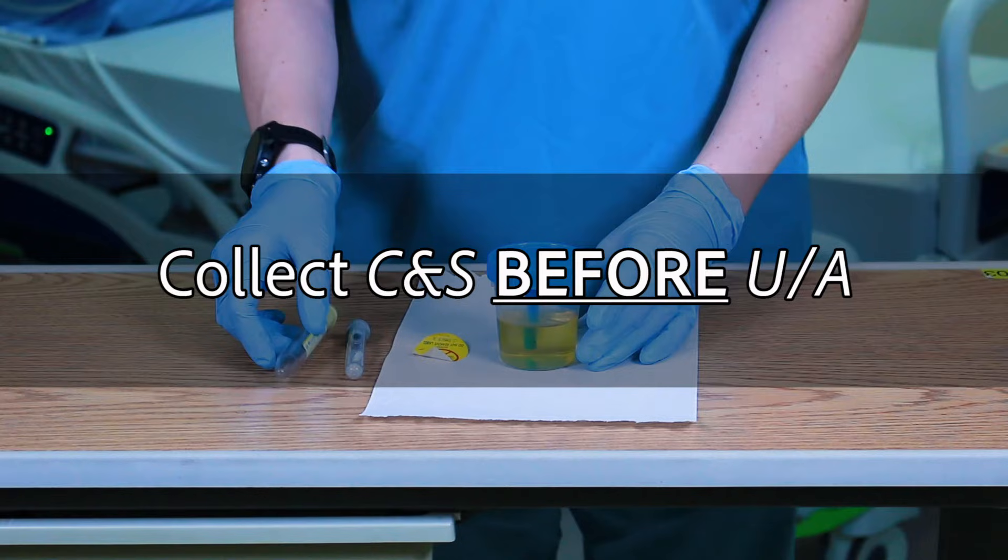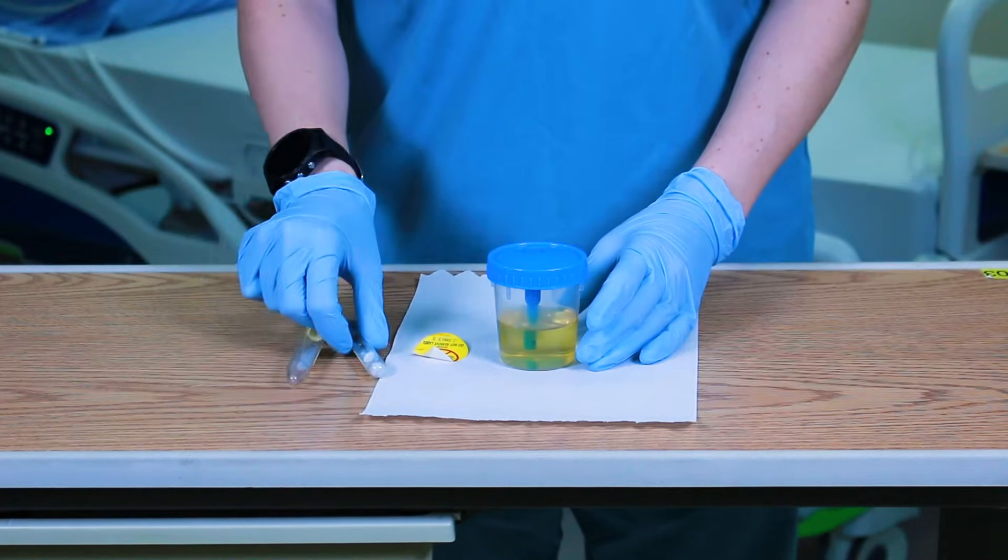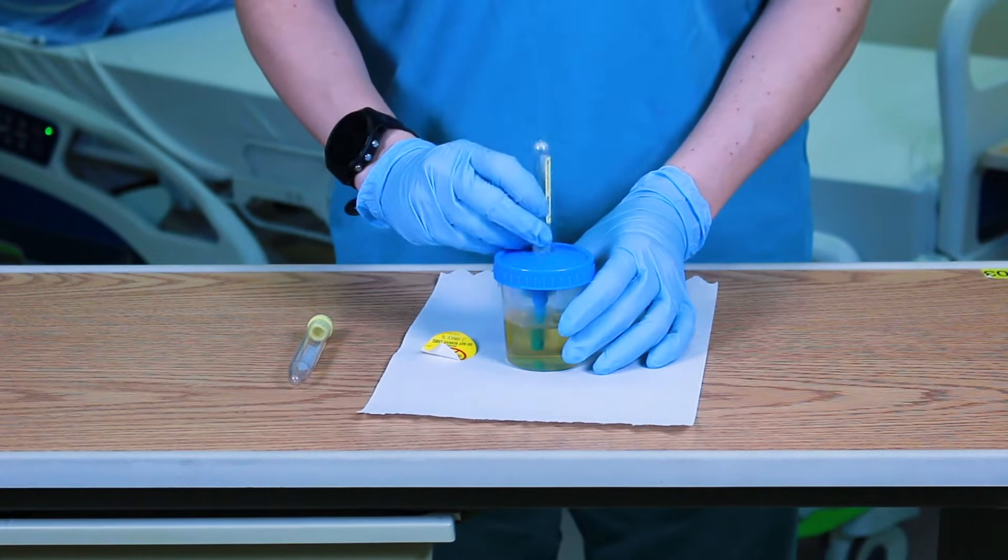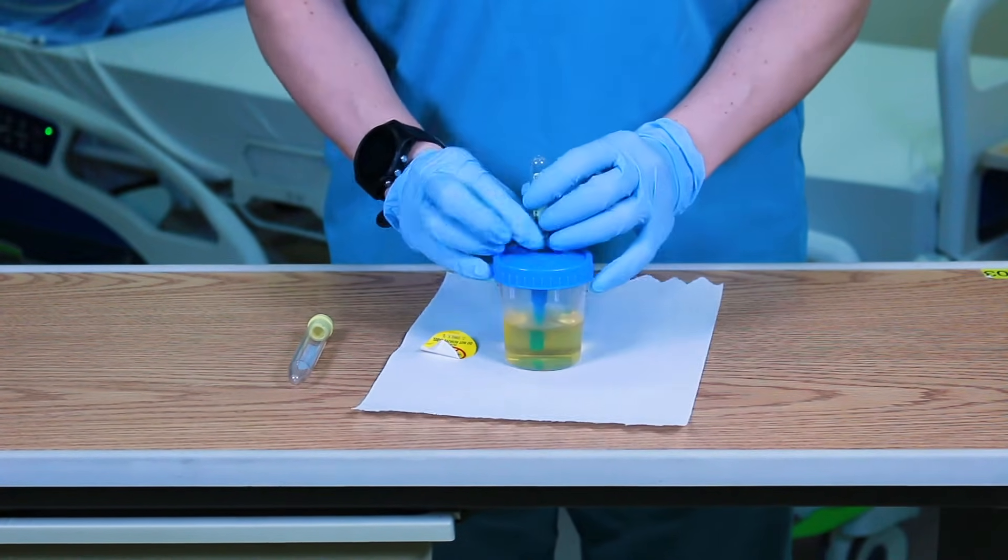If collecting a UA and C&S, collect the C&S before the UA. Place the tube stopper directly over the open transfer device and push firmly down for the needle to pierce the stopper.